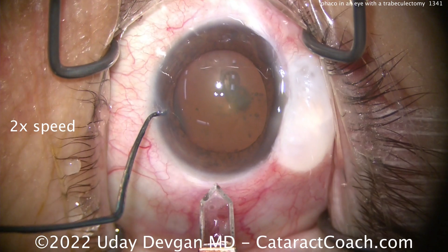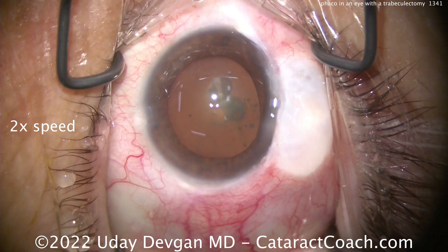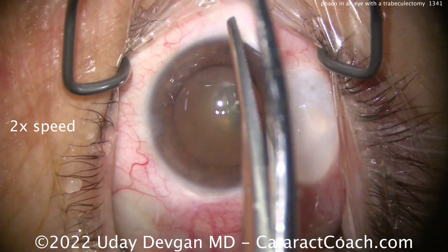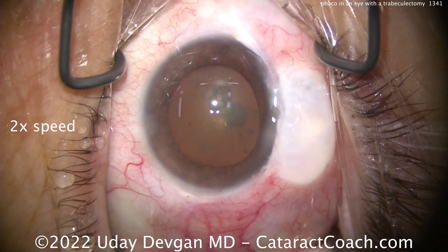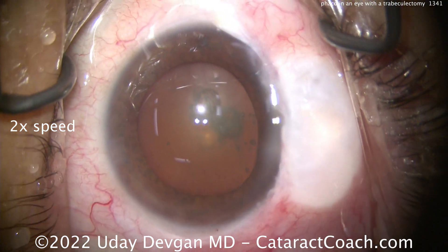Now I'm going to fixate the eye with the chopper and then use the diamond keratome, and notice I'm going to make a little longer incision than normal. We're showing you the whole video at two times normal speed — the reason is I want to get through the whole case. It took about 10 minutes, so the video here is going to be about five minutes.